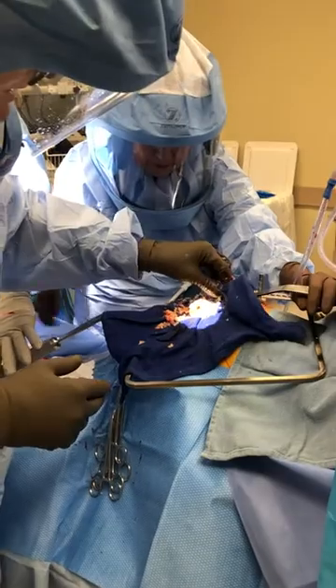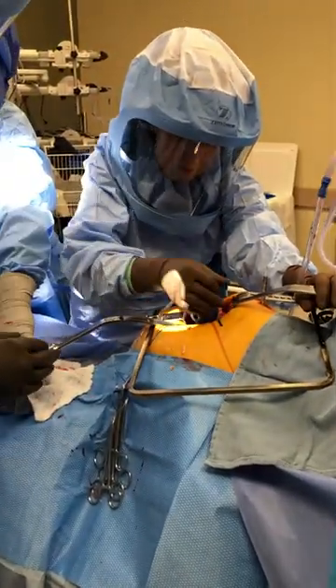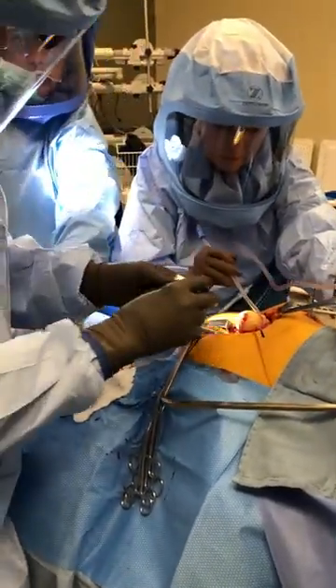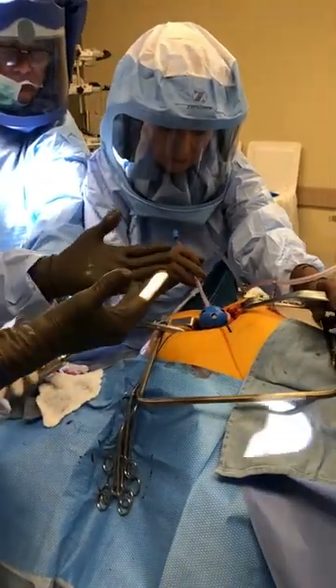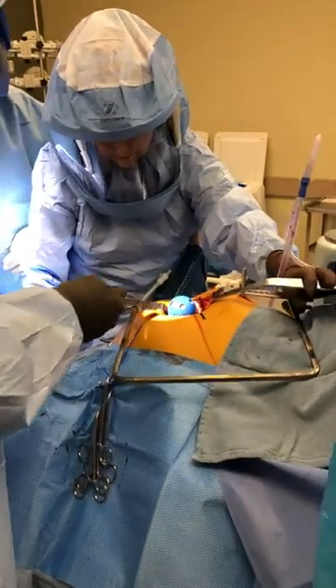If there are any cysts, I cure them out thoroughly — he doesn't have any. So we basically got the head prepared. We're keeping all the debris in here as much as we can. Put the trial on — again, we can visualize through it and see the level. I could now choose to take a little bit more off if I wanted to, but I think this is perfect. I want to do a measured resection on this gentleman.